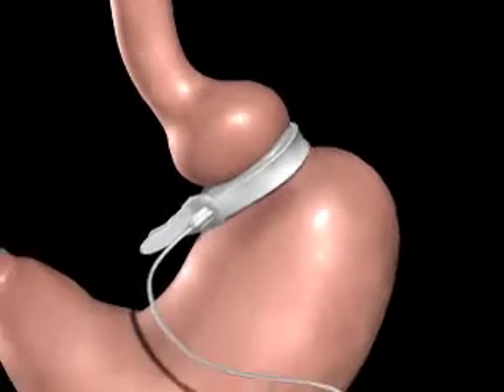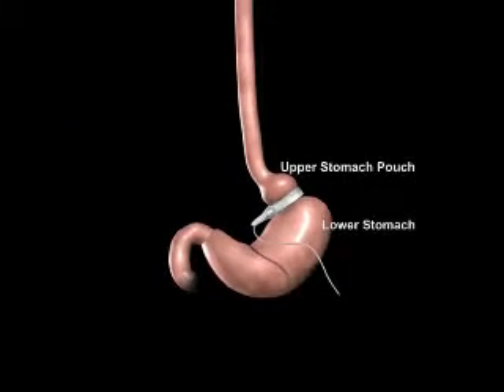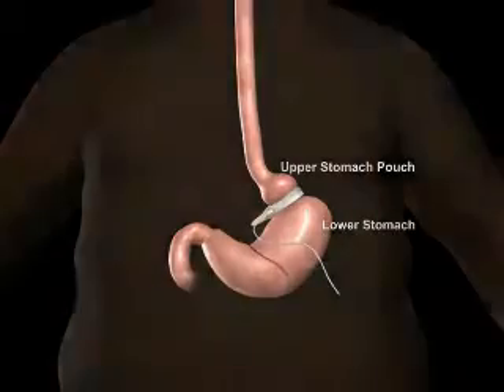A tube attached to the realized band will be connected to the injection port. The port is used to adjust the band tightness after surgery. An incision is made on the upper abdomen to insert the realized injection port beneath the skin.